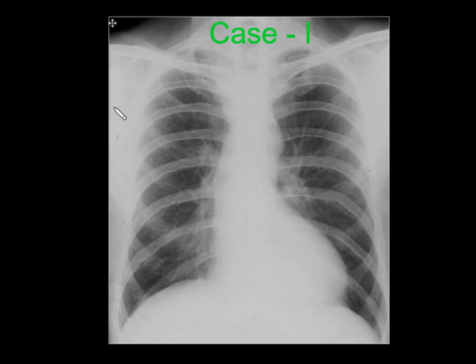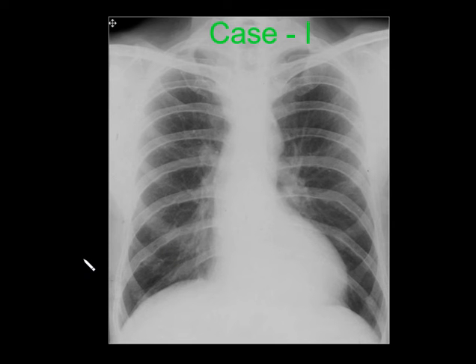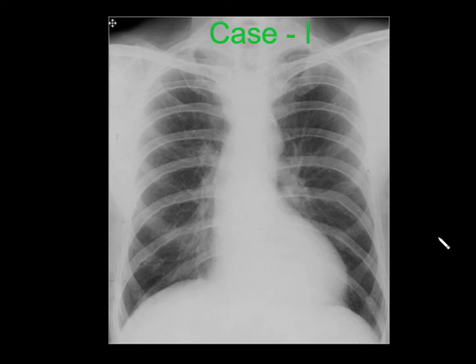Coming to the next case, you can see prominent ascending aorta and arch of aorta, but the descending aorta is not seen, along with classical inferior rib notching. Whenever a spotter is placed in the exam and you cannot find other abnormal findings, try to see the ribs — it may be a case of coarctation of aorta. This bilateral inferior rib notching is most commonly seen between the 6th to 9th ribs, due to dilated intercostal vessels causing subperiosteal bone resorption.